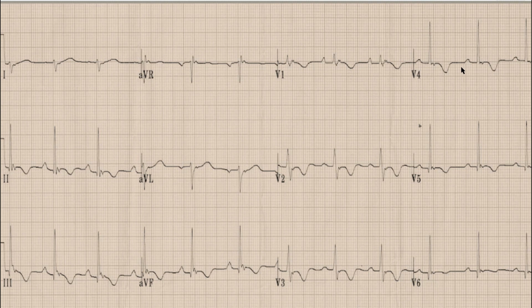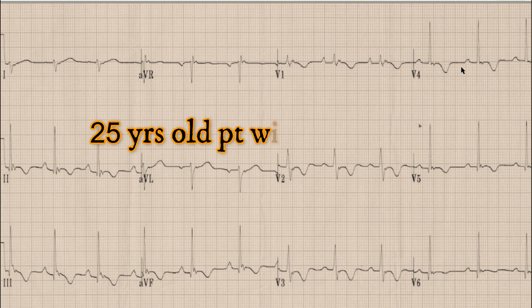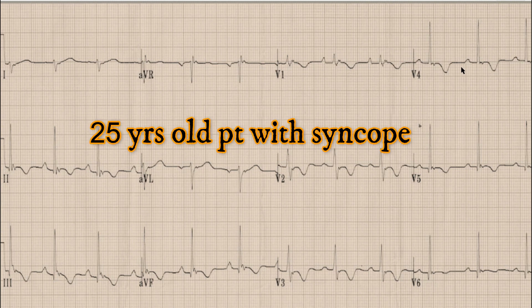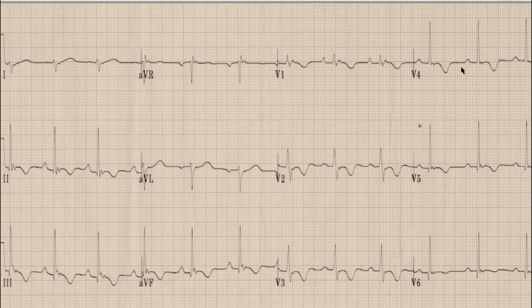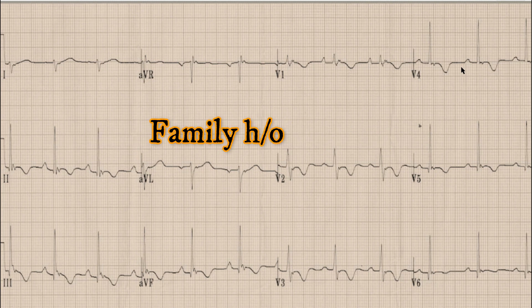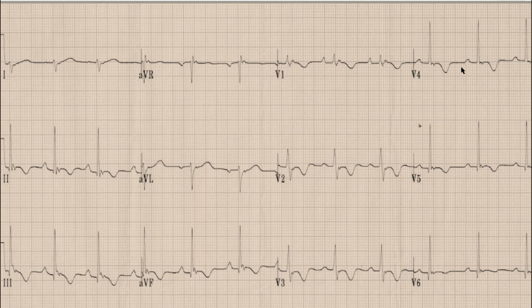This is the ECG which we are going to discuss today. It is the ECG of a 25-year-old boy who presented with acute onset syncope. The patient had a family history of sudden cardiac death, with his father dying at age 33 with sudden cardiac death.